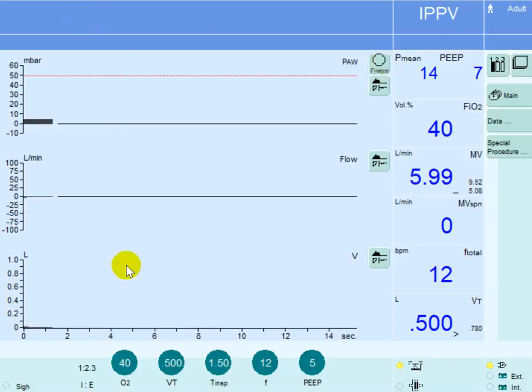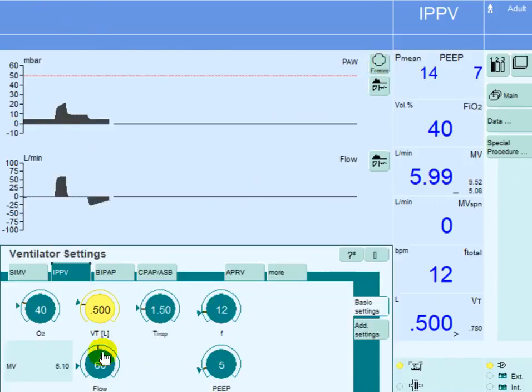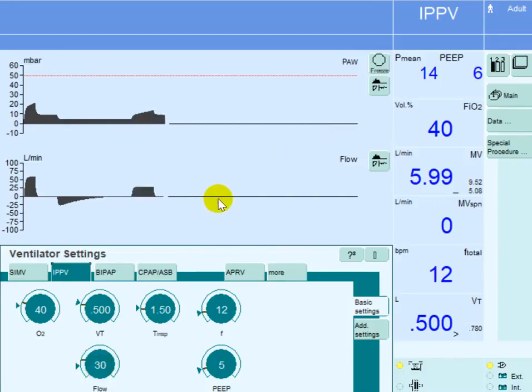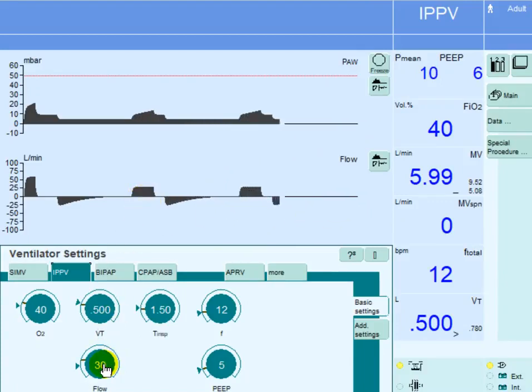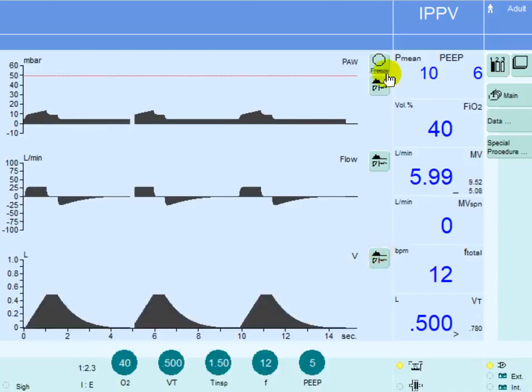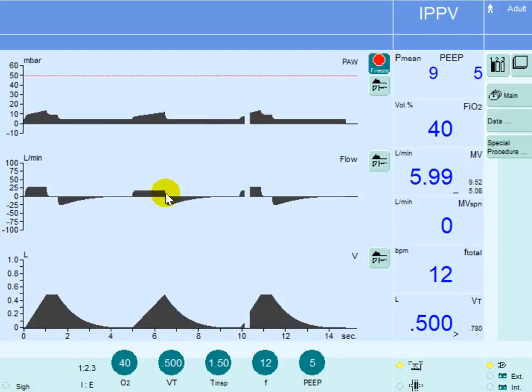Now let's see what happens when we decrease the flow rate. We're going to go down to a flow rate of 30 again as baseline, then compare with a lower flow rate. I will decrease the flow rate to 20 liters per minute and see what happens. At 20 liters per minute it will require a longer time to deliver that 500ml tidal volume — in fact it takes 1.5 seconds.